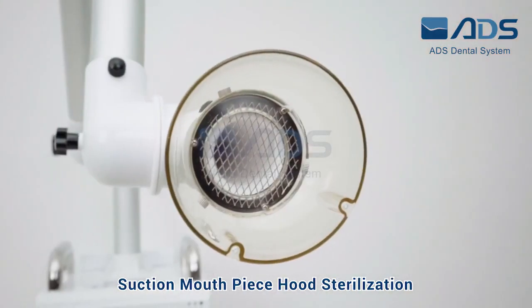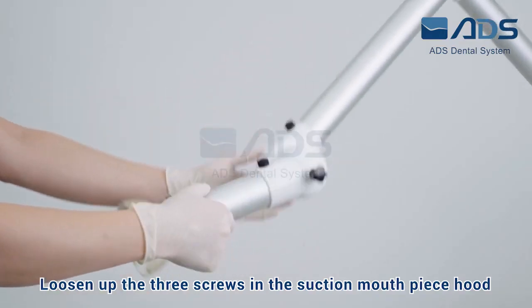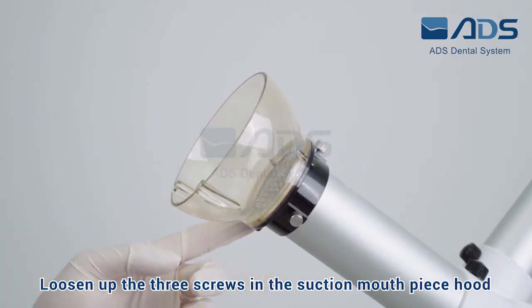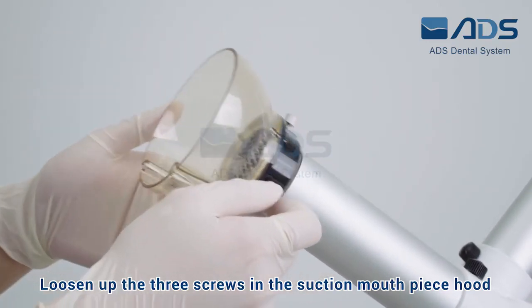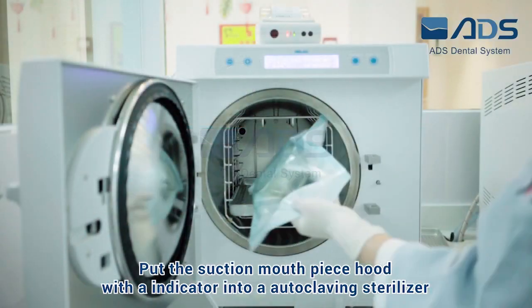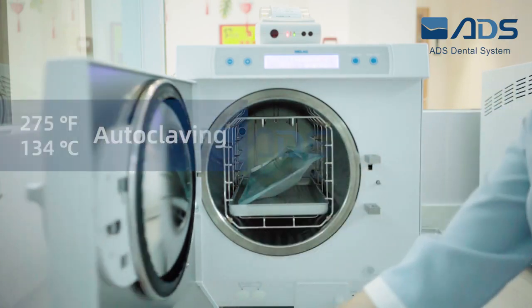Suction Mouthpiece Hood Sterilization. Loosen up the 3 screws in the suction mouthpiece hood and remove it. Place the suction mouthpiece hood in the bag used for autoclaving at 275 degrees Fahrenheit (134 degrees centigrade). Put the suction mouthpiece hood with indicator into an autoclaving sterilizer.